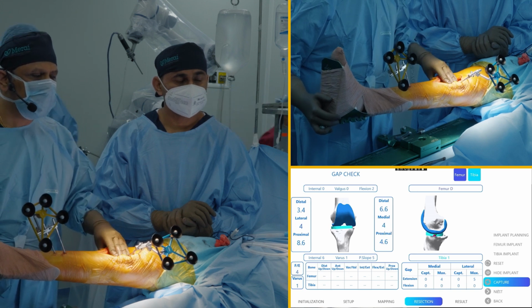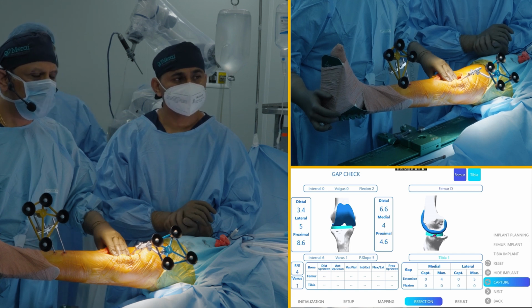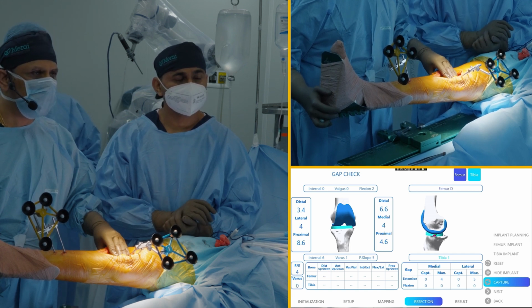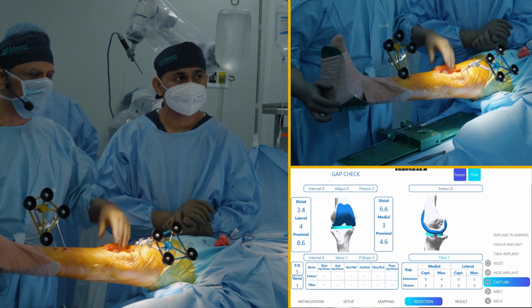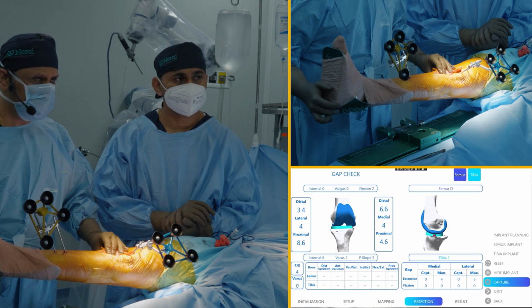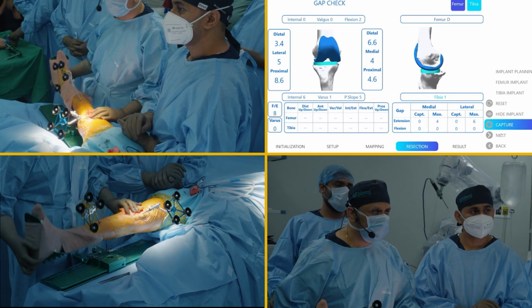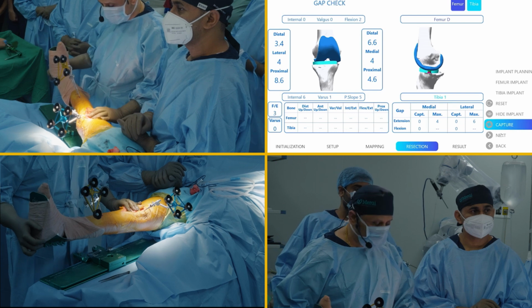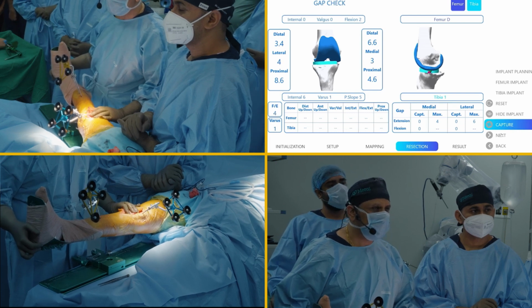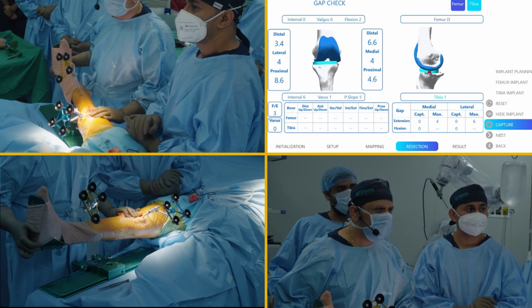So it is generating a gap of 5 and 4, or basically 4 and 4, and this is the gap which is generated. Now I see what the deformity is. If you see the flexion extension, the sagittal deformity of the knee is almost a neutral knee, without stressing. So the sagittal deformity is 1 to 2 degrees of flexion deformity, and the varus is 0 degrees.